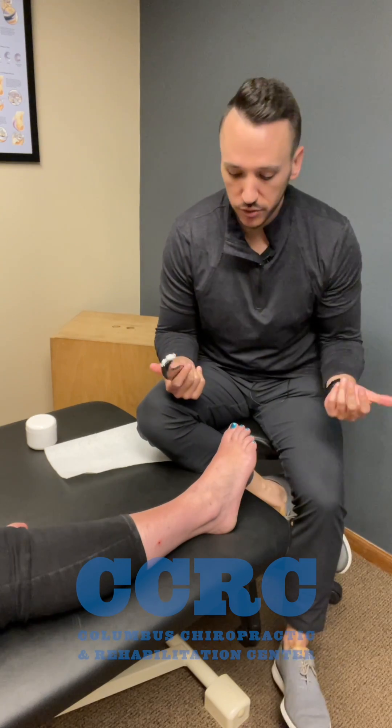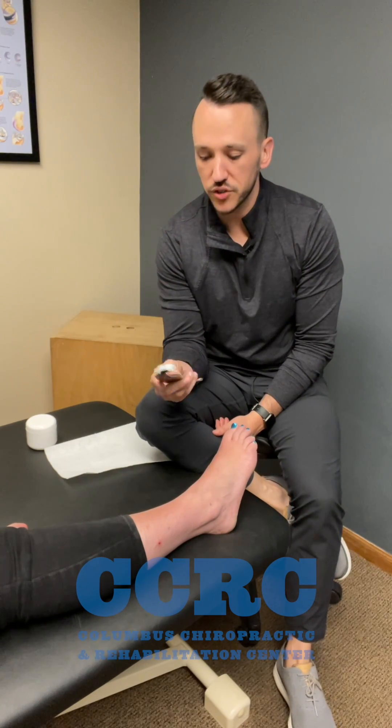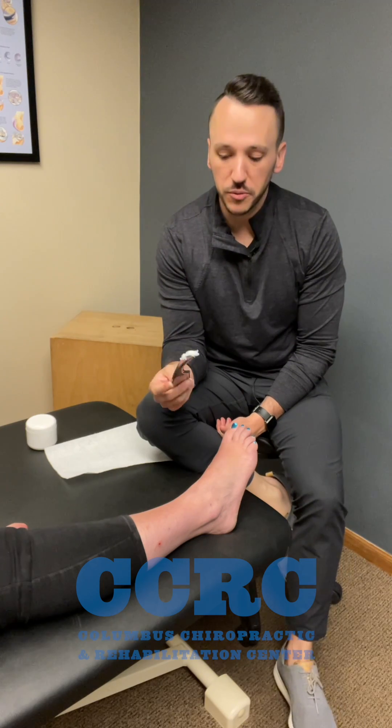In this video I'm going to go through another technique that we can use post lateral ankle sprain, and that's instrument assisted soft tissue mobilization — scraping, as many people may call it.